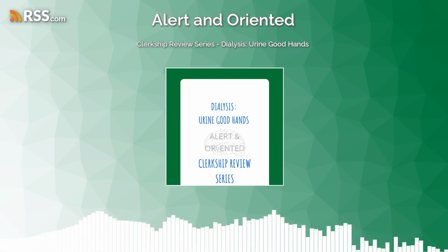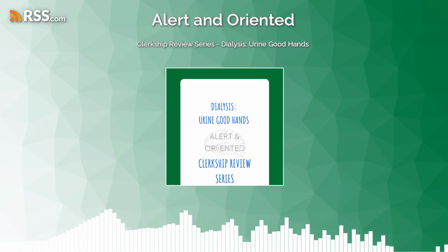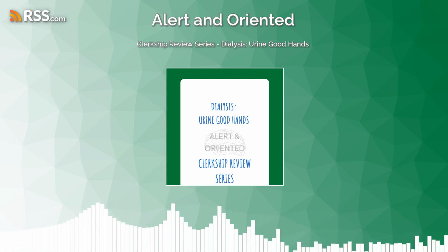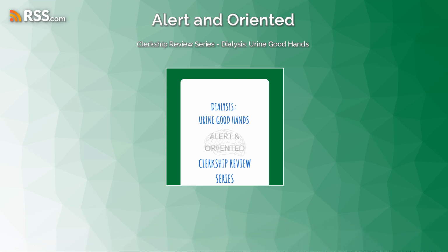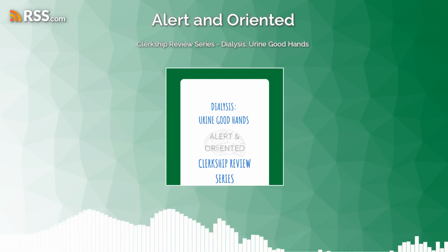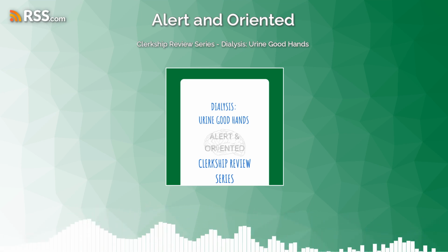And that stands for prolonged intermittent renal replacement therapy. So the renal replacement therapy part makes sense. It's essentially blood purification, but the prolonged intermittent essentially refers to a longer than 3 to 5 hours. So these treatments usually run somewhere between 8 to 12 hours. And the reason we do these is because patients may not be as healthy or as hemodynamically stable to do a 3-hour treatment, but they may also not be as sick that require a 24-hour treatment.